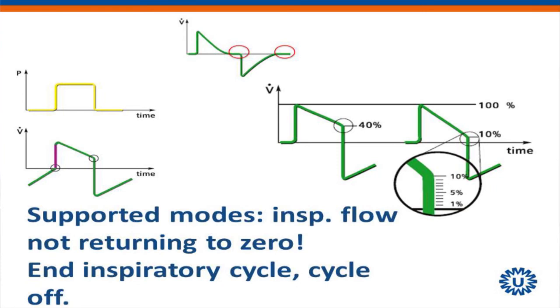If it's too short, you can choose up to, I think, 70 or 80. What will happen if you do that?